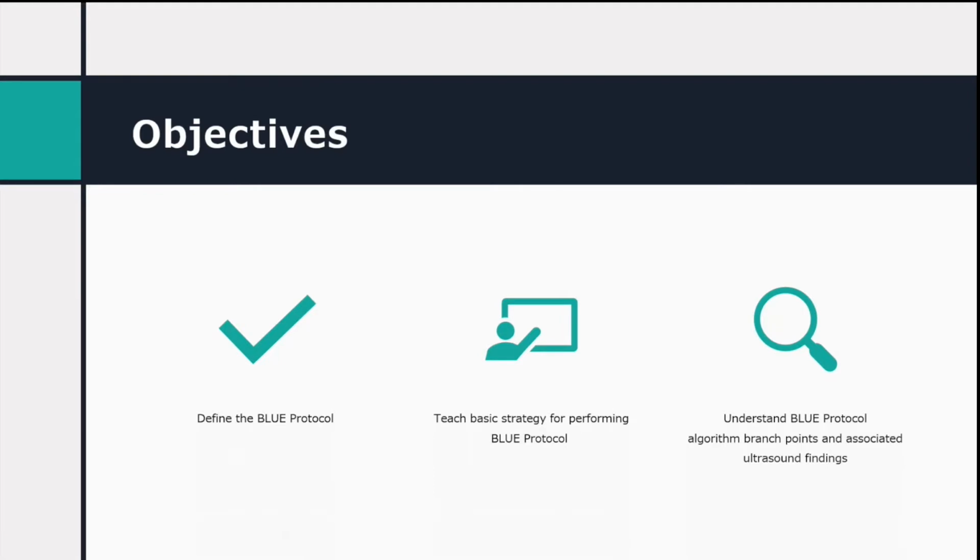So the objectives for this talk will be to define the Blue Protocol, teach the basic strategy for performing the Blue Protocol, and understand the Blue Protocol algorithm, its branch points, and the associated ultrasound findings.